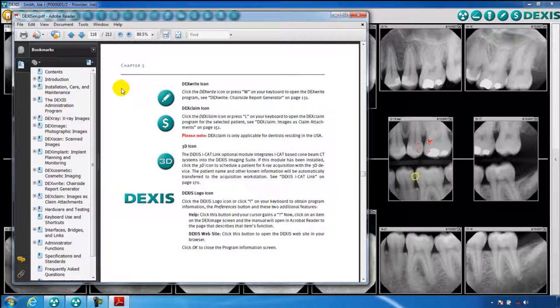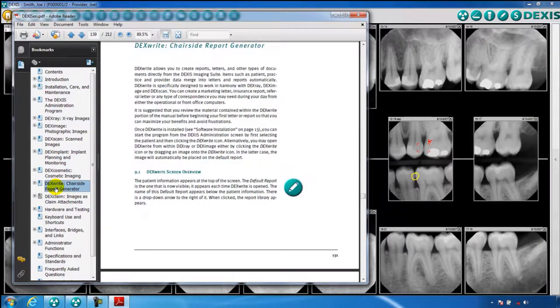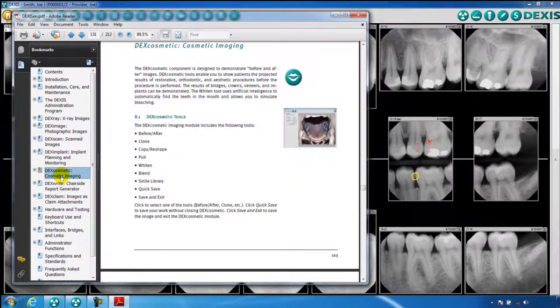Once the manual is open, you can then navigate through it by utilizing the index located in the left margin.